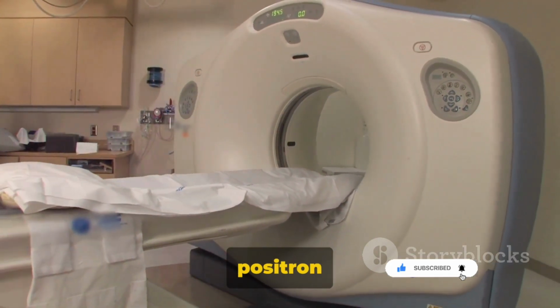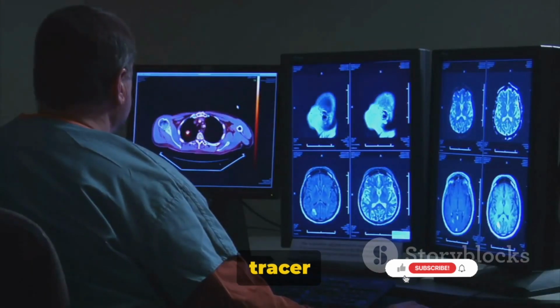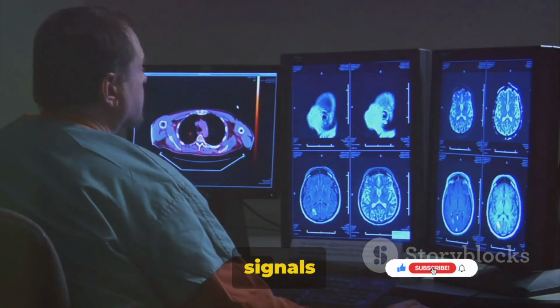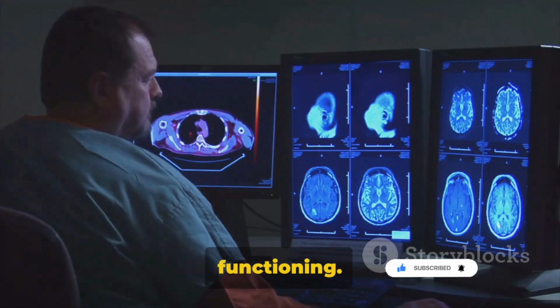Now let's talk about positron emission tomography, or PET. A PET scan involves the injection of a small amount of radioactive tracer into the bloodstream. This tracer travels to the brain and emits signals that are picked up by the PET scanner. The signals are then converted into images that show how different brain regions are functioning.